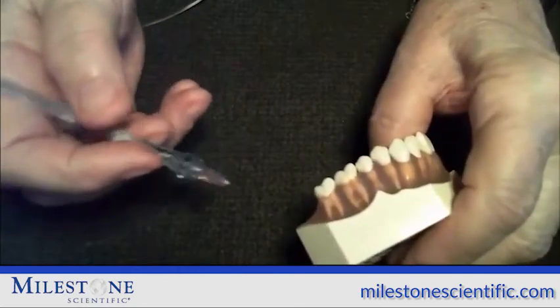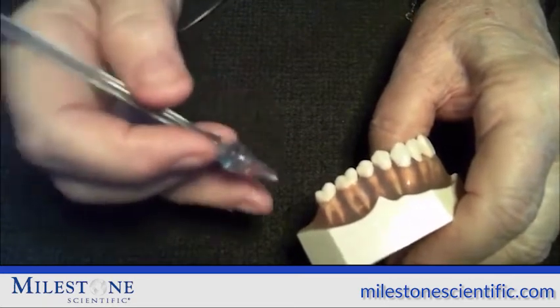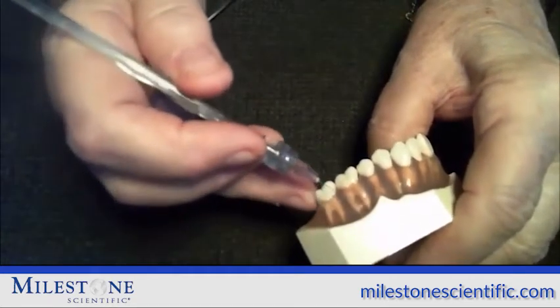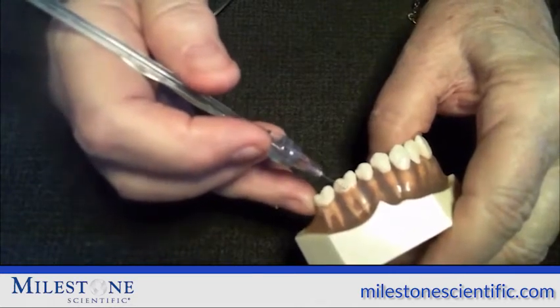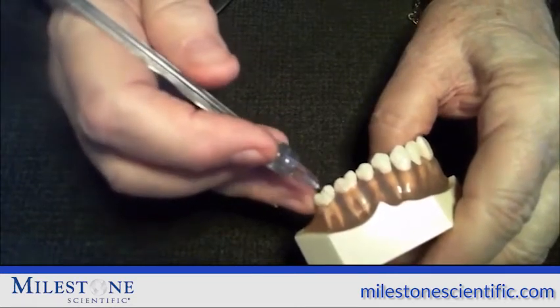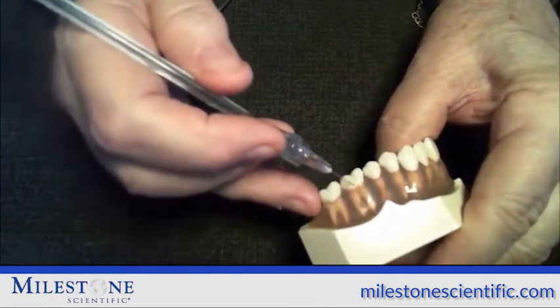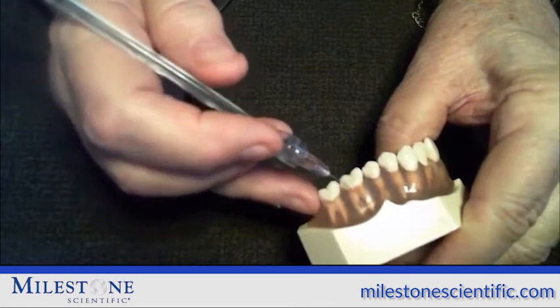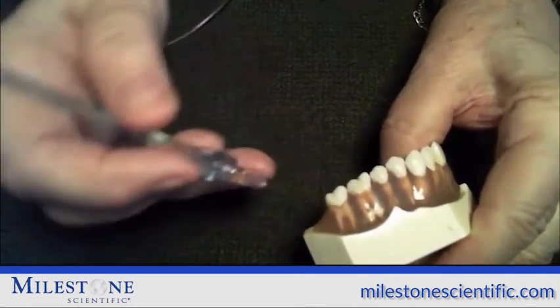This injection is different than the traditional PDL injection in that we're not going to use force or pressure to force the anesthetic down the PDL space to the apex of the tooth to get a short duration of anesthesia. Instead, we're going to put the needle into the sulcus and move it down until we reach resistance and then let the anesthetic flow into the bone around the tooth.